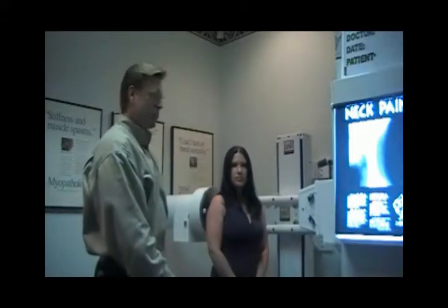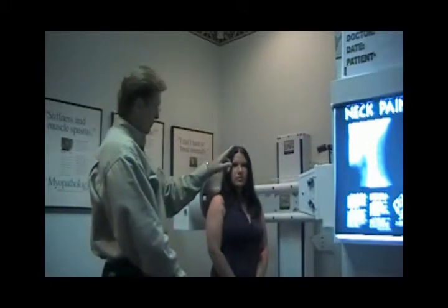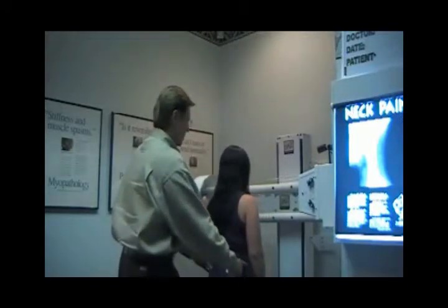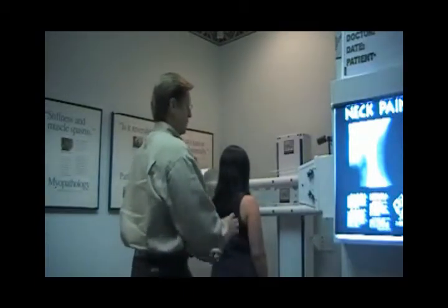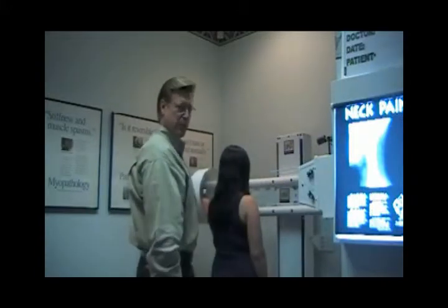Once we get it up to her shoulder level, we're going to go ahead and have Rachel face inward towards the wall, have her left hand touch over here, take a step to her left, and I'm going to raise this up just a little bit more, and we're going to ask Rachel to bring her head all the way down towards the floor and up towards the ceiling 3 times.